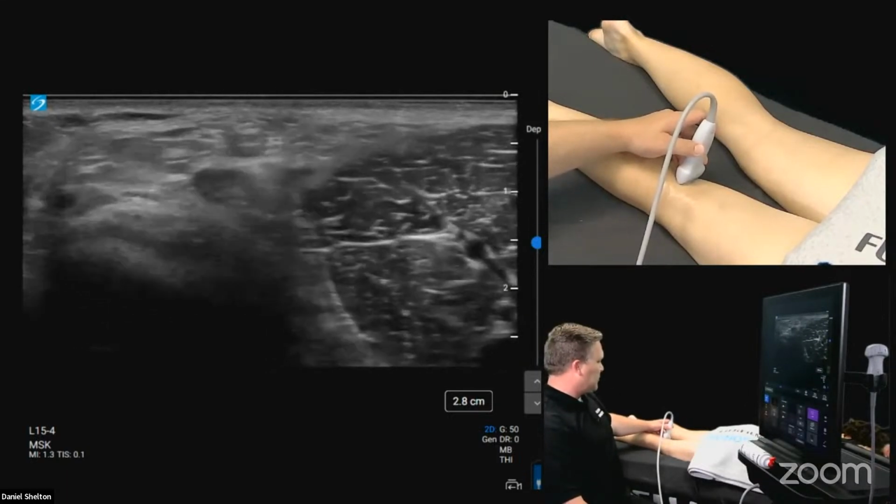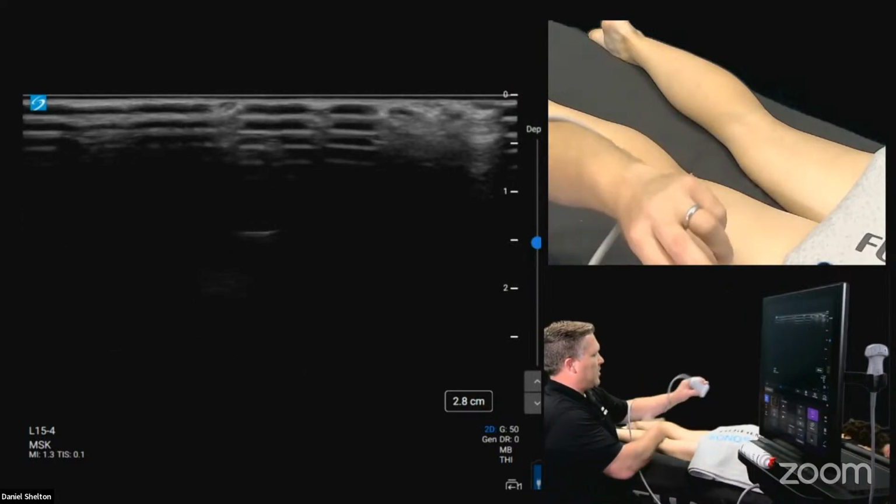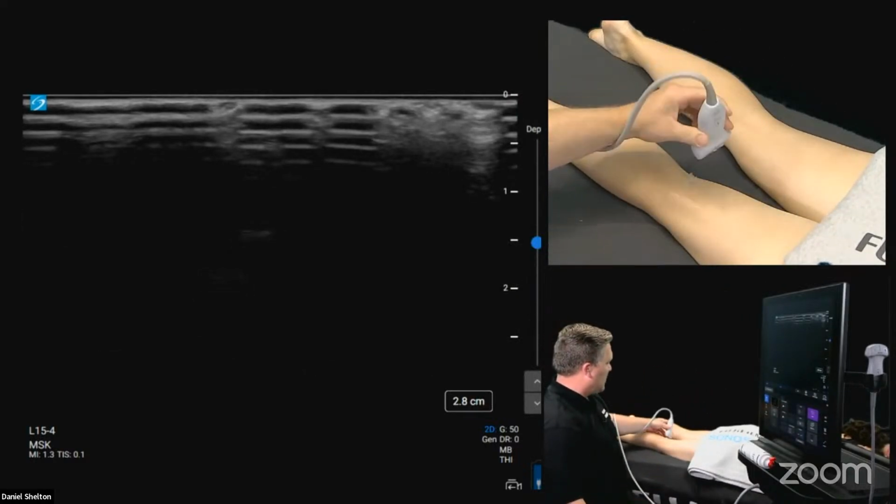troubleshooting. And to troubleshoot this, let me get the cord out of your way. I like to wrap it around my arm anyways. It makes it easier to scan.